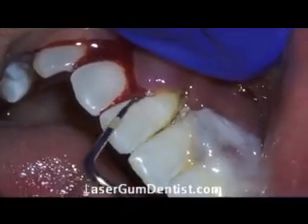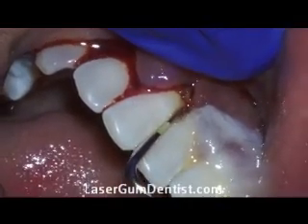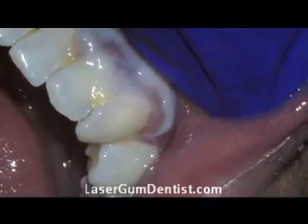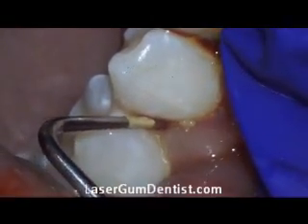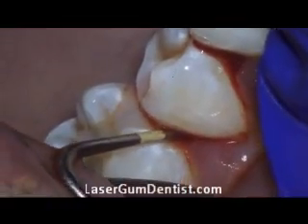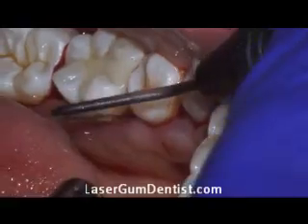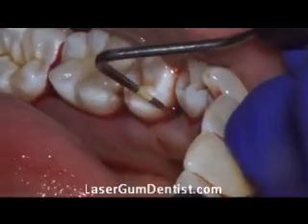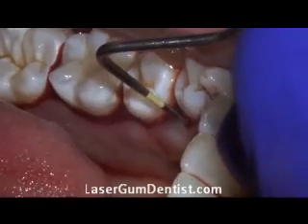Your gums should not bleed when you brush or floss. Look — this is an interesting moment in this video. If you look on the other side, that is the after — that's one week after — and it looks like a scab. The mouth is a wet environment, so after one of these procedures, especially on advanced cases, the tissue doesn't look very nice at one week. We did this patient half his mouth one week and then the other half the next week, so you get to see what it looks like one week after. But even though it doesn't look nice, the patient doesn't feel much discomfort.